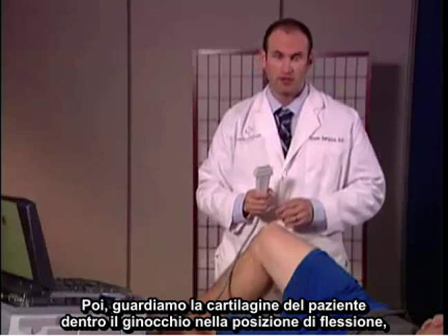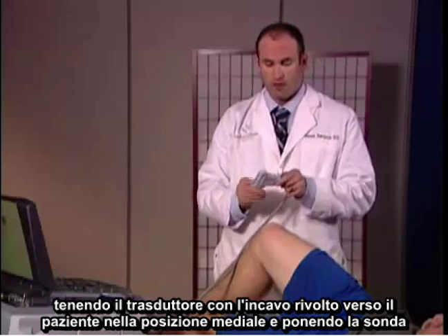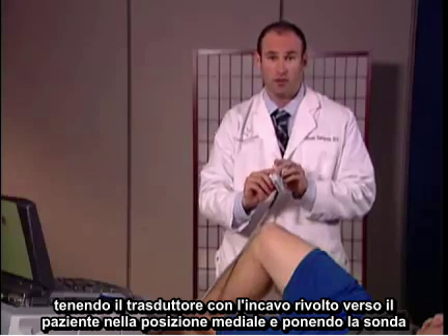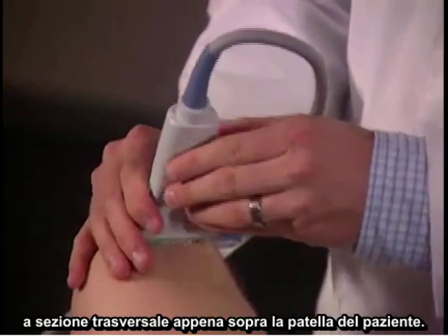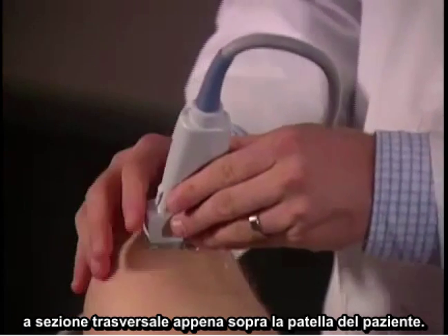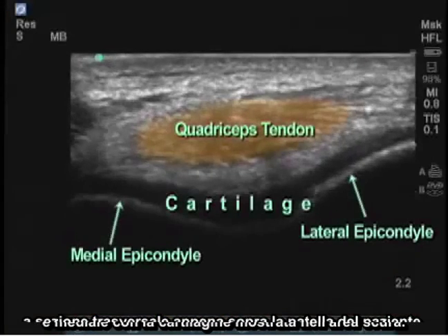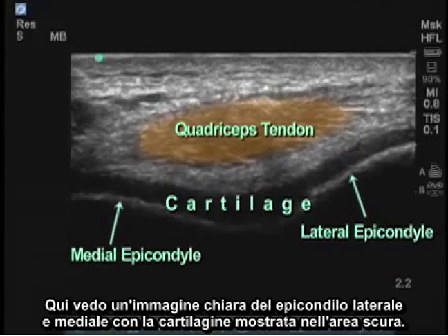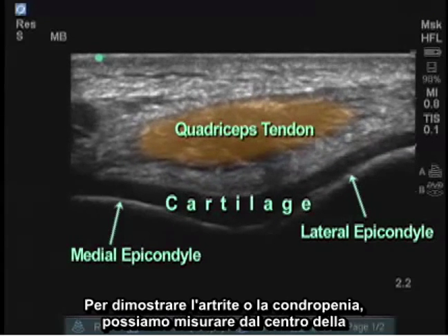Next, we're going to take a look at the patient's cartilage with the knee in the flexed position. By holding the transducer with the notch facing towards the patient in the medial position, I'm placing the probe in cross-section just above the patient's patella. Here I see a clear image of the patient's medial and lateral epicondyles with cartilage shown in the area of blackness.